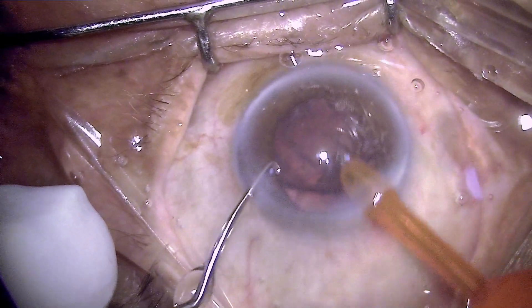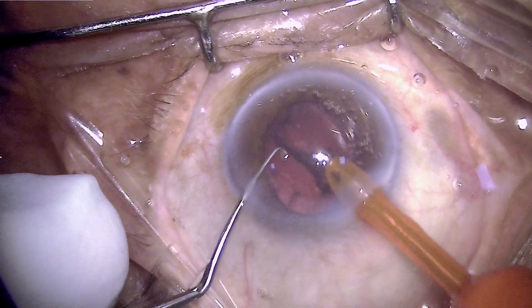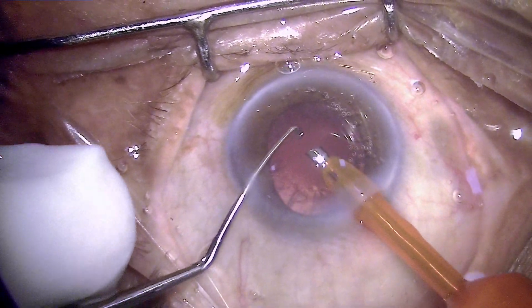Once we have removed all of the nucleus, a very thin film of epinucleus is left behind which can be safely and efficiently removed using the phaco tip.